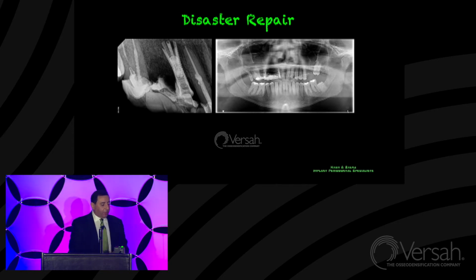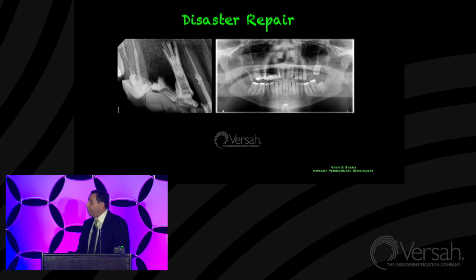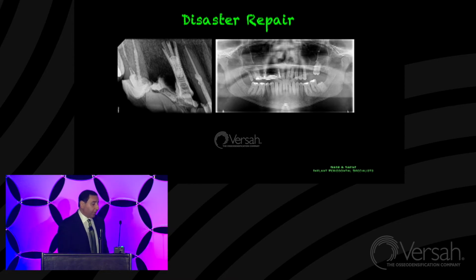So when I looked at this, I asked him, I don't see the implant on the panoramic image that you sent me, so what happened here? Did it fall out? He said, yeah, I removed the bridge and it just came out. So I just made him a temporary bridge, which leaves a lot to be desired as far as the design, and I told the patient to come see you.